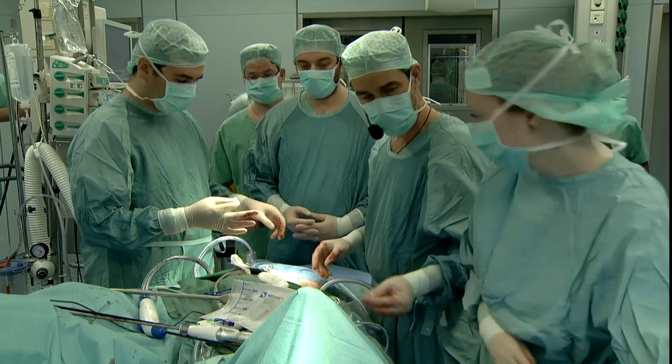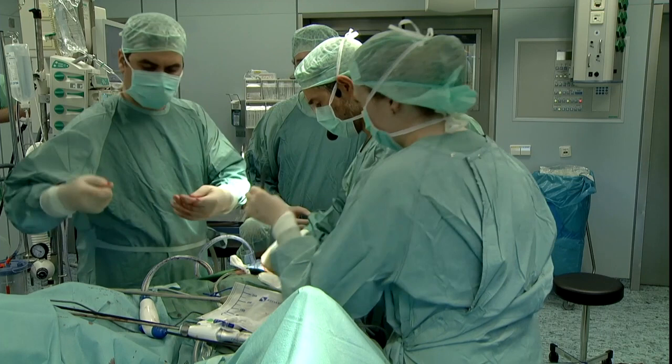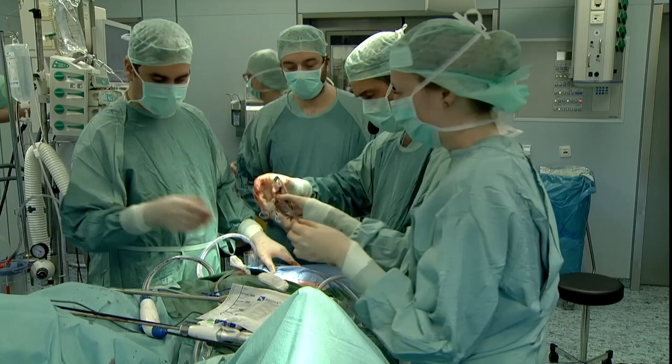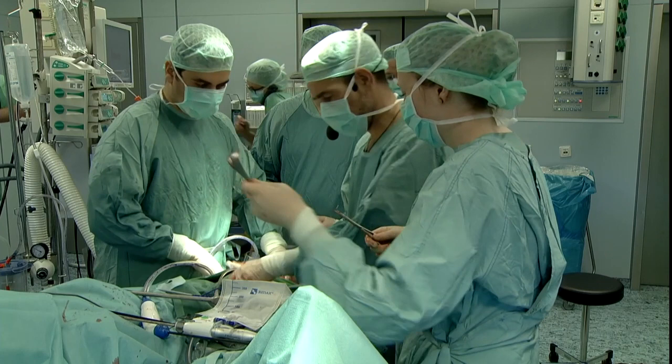Give me knife. Can the table come? Okay. The nice thing about the extraperitoneal approach is if you do find a hernia and you don't have a big tear in the peritoneum, you can repair the hernia with a mesh. Disconnect this for a second. But in this case, the risk of the bowel sticking to the mesh is high, so I wouldn't do it.